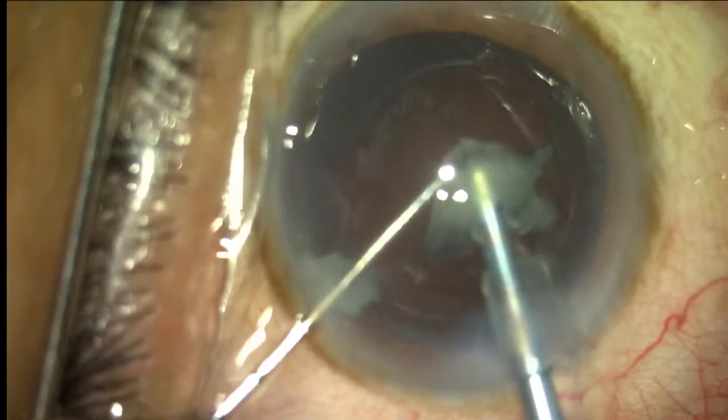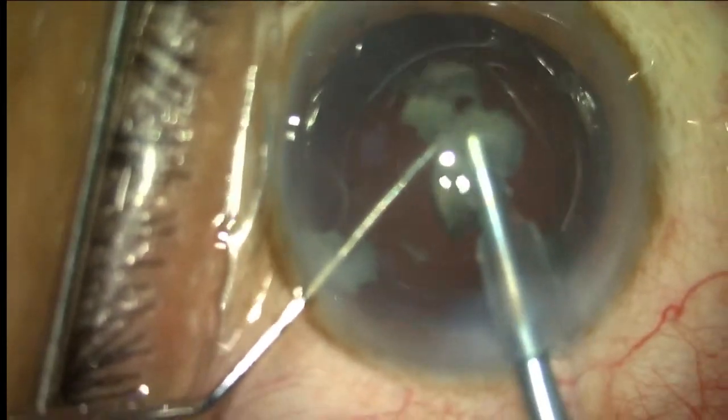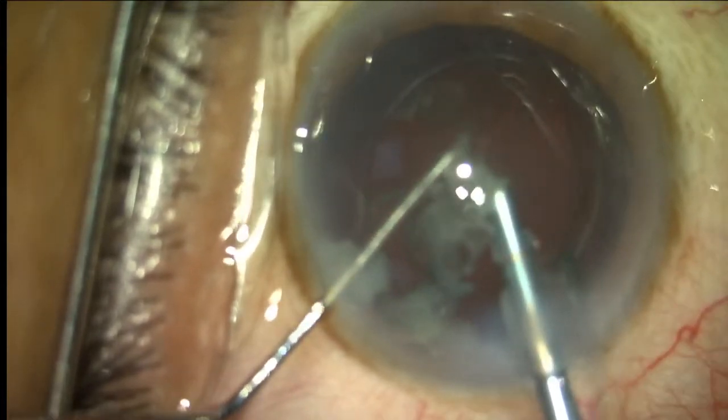Please increase the vacuum a little bit, just to be on the safer side. Cornea saline, please.